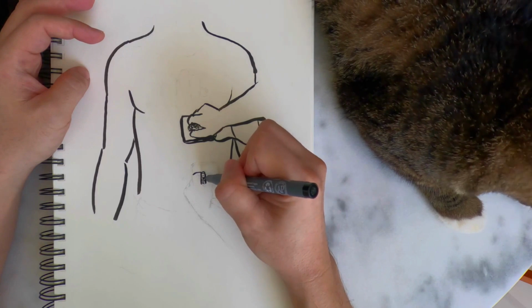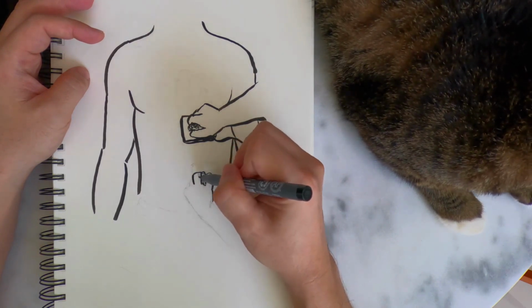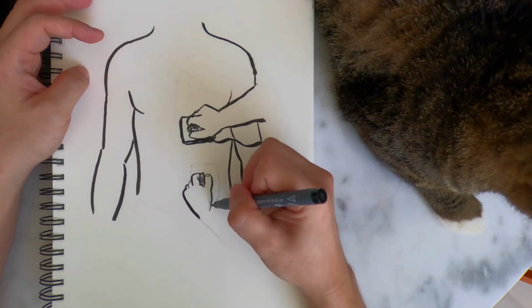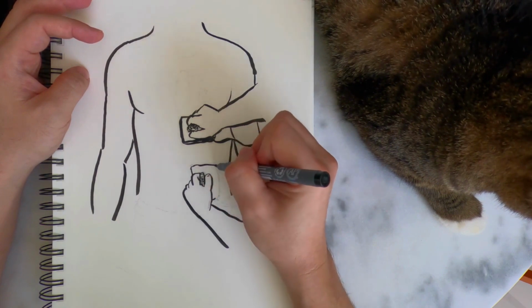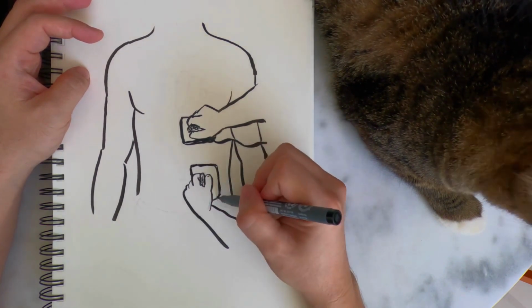However, some people have asked me if it is okay to place one pad under the left nipple as usual and the other pad on the stomach instead. This is not advisable, as this method may not be effective since the other pad is on the stomach. It is sometimes asked why we need to avoid certain placements.